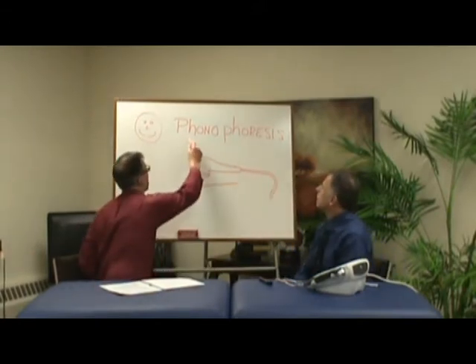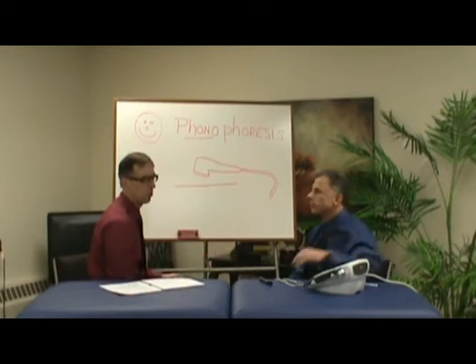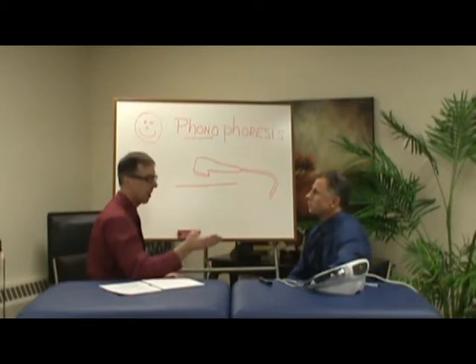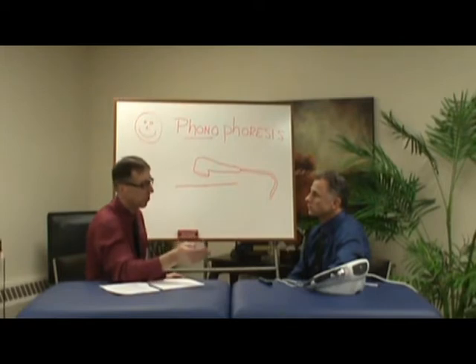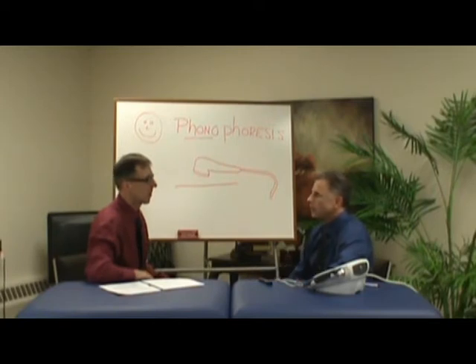All right, well, phono just means sound, and in this instance they're actually just referring to the ultrasound, which are ultrasound waves. Which, by the way, we should mention, many people have heard of ultrasound, but they think of it in terms of diagnosis, looking at their baby, pregnancy, or looking for a blood clot. This is a different type of ultrasound. This is treatment ultrasound, not diagnostic ultrasound, so we're actually using the waves to treat as opposed to diagnose.